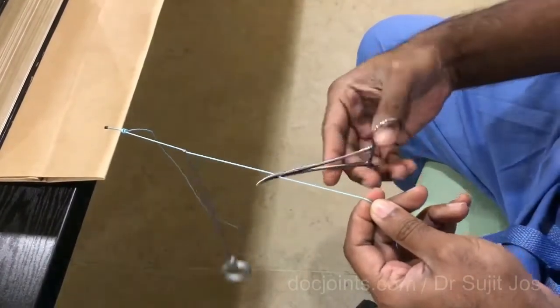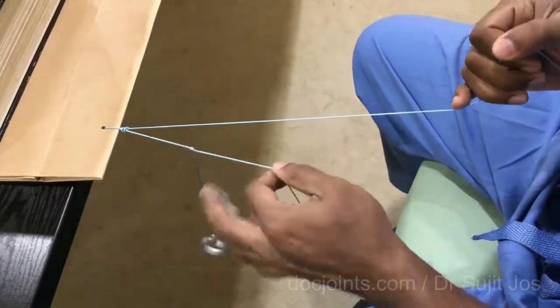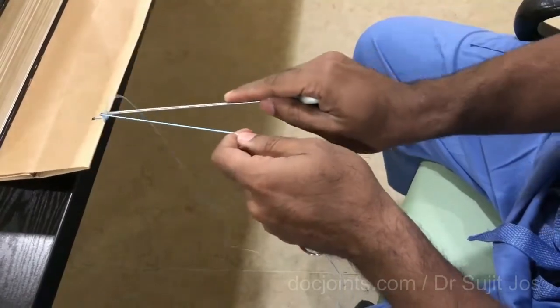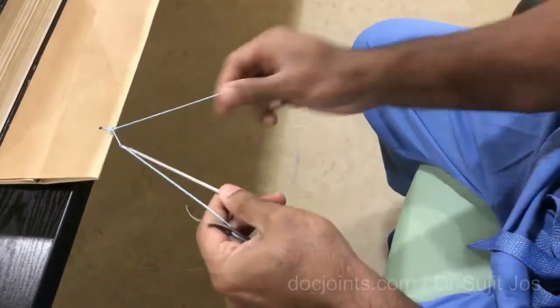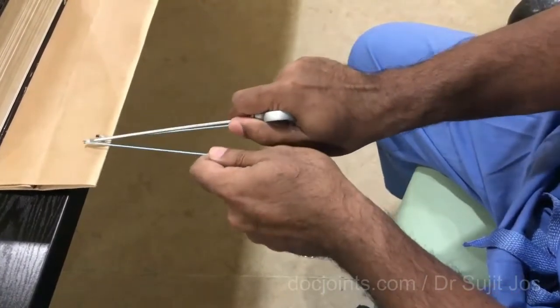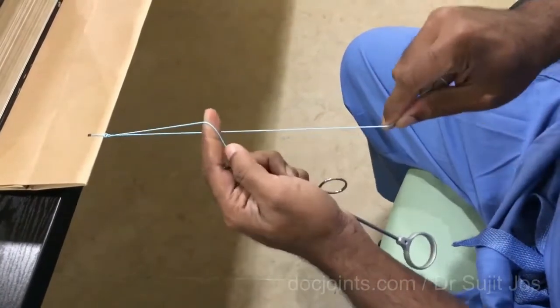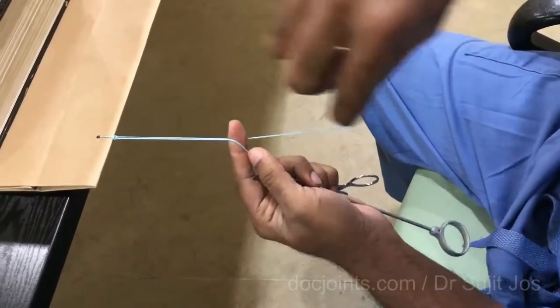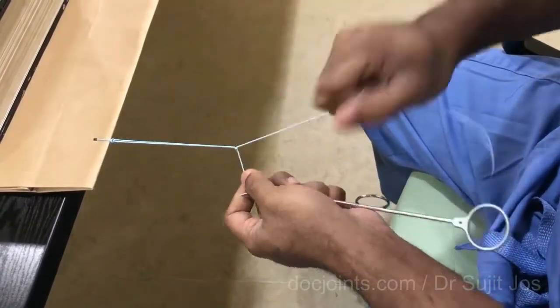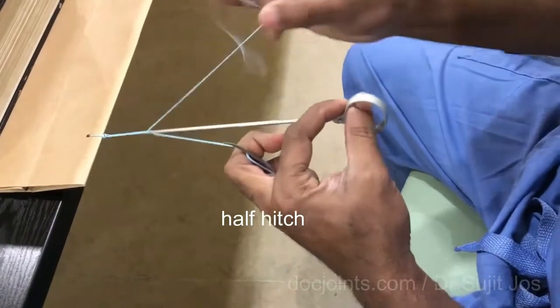What I do is shorten the post now — these are now of almost equal length. Shorten this and use the knot pusher to tighten this. Or you can pass it like that to pull and tighten the knot. Now put three half hitches to tighten this. I use one to the right, then use a knot pusher to push it to the position you want.